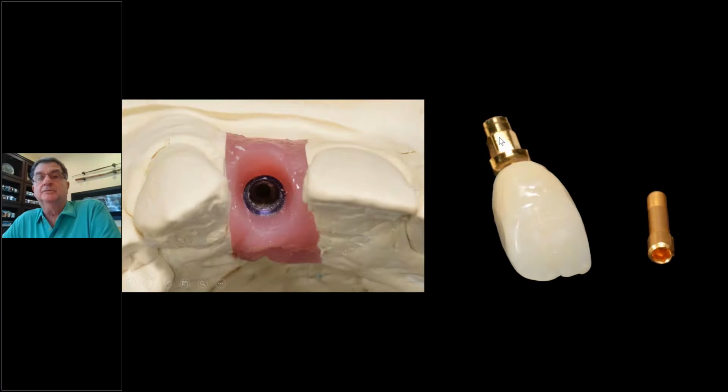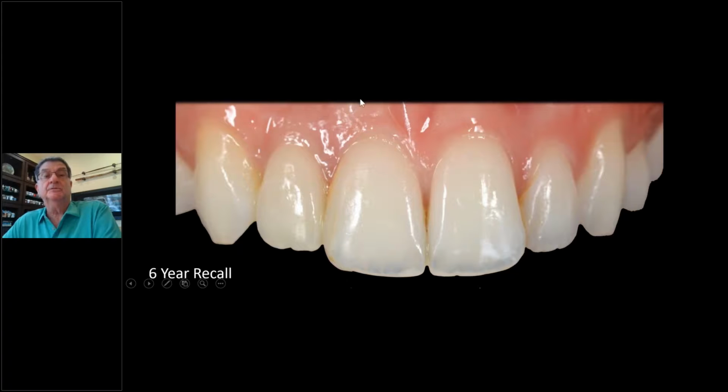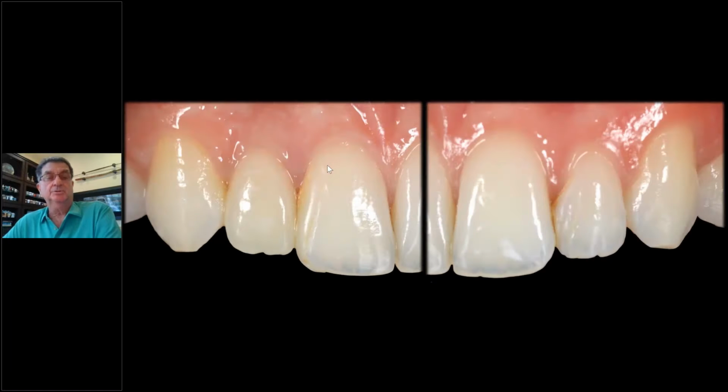And there's now the final crown. And here it is, 1 year recall. Here it is at 6 years. Nothing was ever done to that so-called scar. 6 years later, there you see a close-up. Now, this is more than adequate, I think, in terms of what we need on thin tissue that was built up with some bone graft, placed to the palate, vertical incisions, and this is what we see. Beautiful tissue height. The key is going to the palate and coming out the cingulum. Screw down, and this is where we are today.